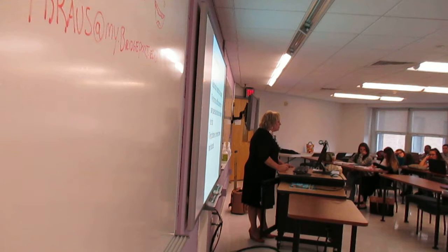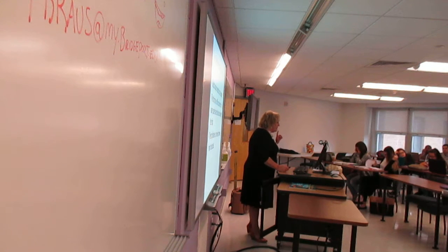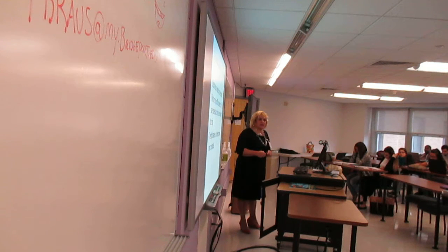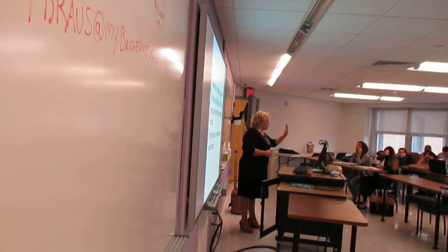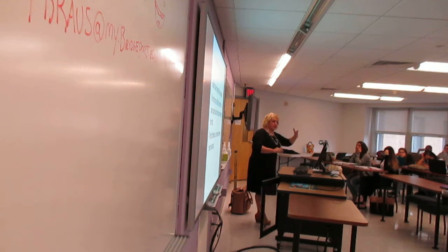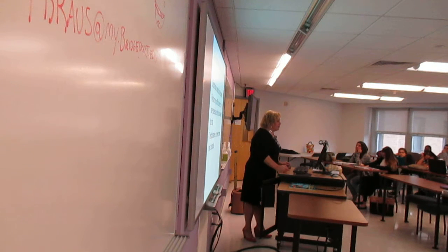So the chip is back. We are using it. There's a study right now. The American Academy of Periodontology is this weekend, and they're talking about using this for peri-implantitis and mucositis. Because it's so thin, it can get into that area, and because usually the threads of an implant are exposed at that time, it has something to adhere to, as opposed to a smooth glass-like tube. So in the upcoming year, we'll find out more about the perio chip.